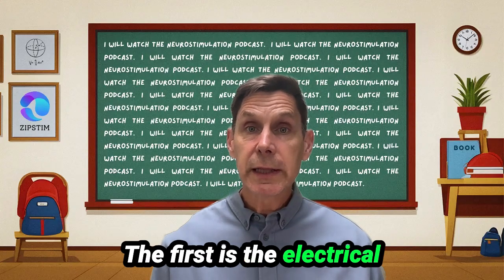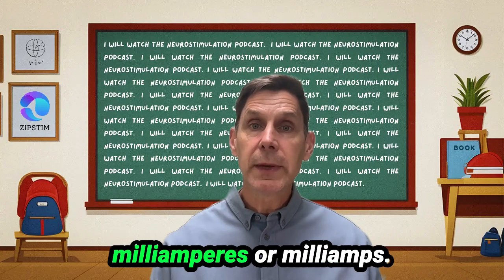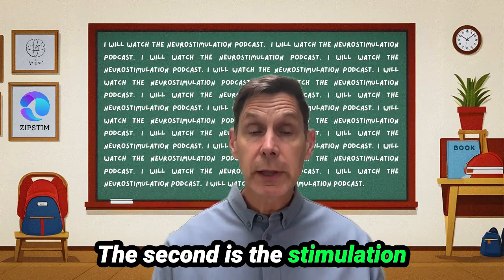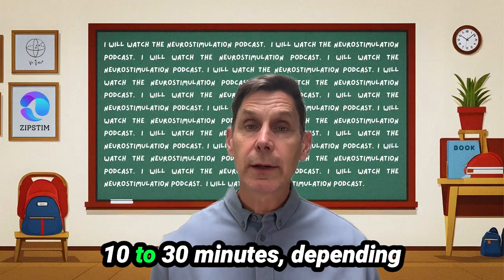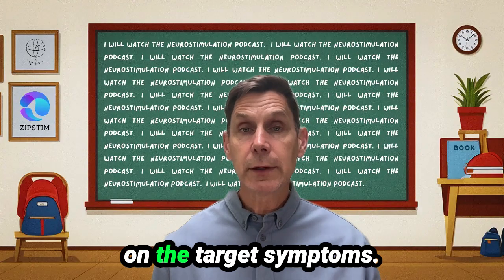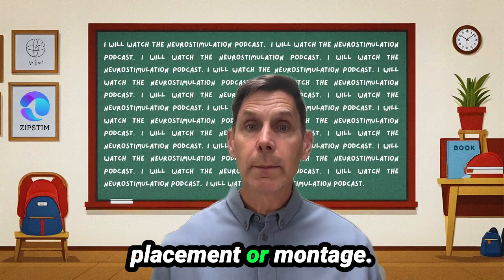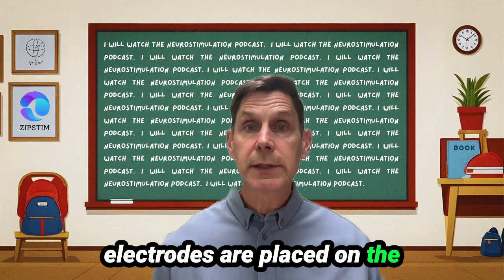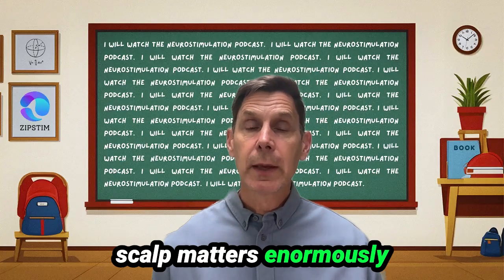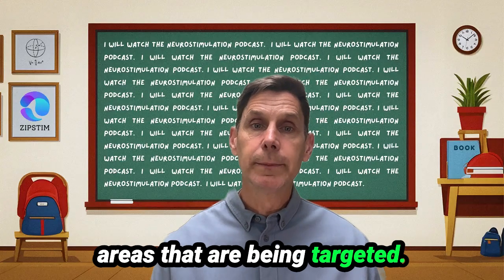The first is the electrical current intensity. This is typically between 1 and 2 milliamperes or milliamps. The second is the stimulation duration in a single session, and that's ranging between 10 to 30 minutes depending on the target symptoms. The third thing is the electrode placement or montage. And so where the tDCS electrodes are placed on the scalp matters enormously, because this is going to influence the underlying brain areas that are being targeted.